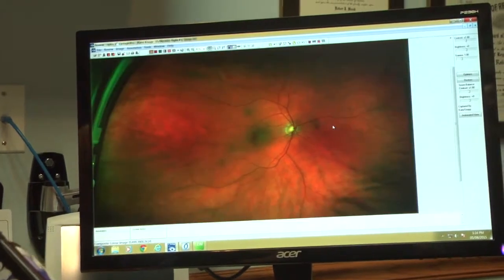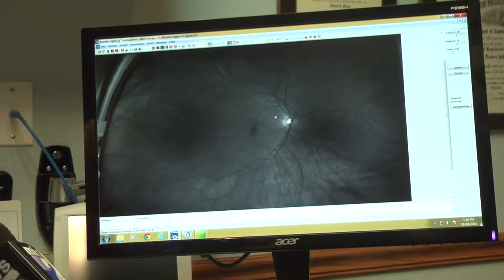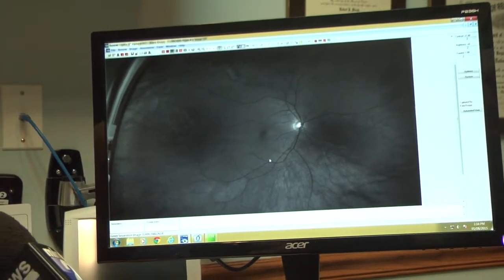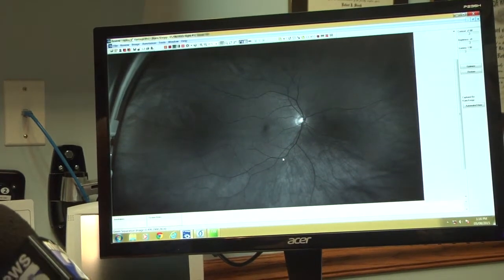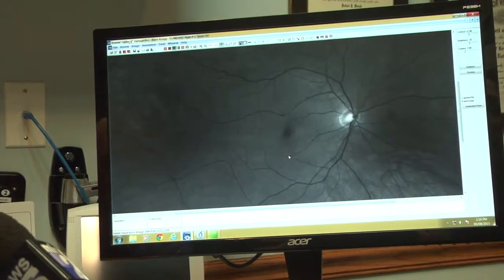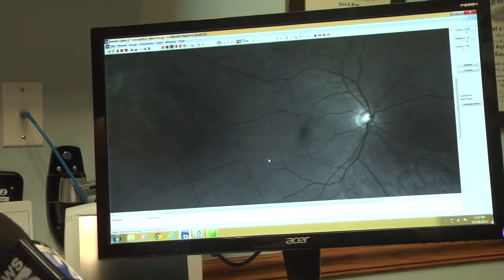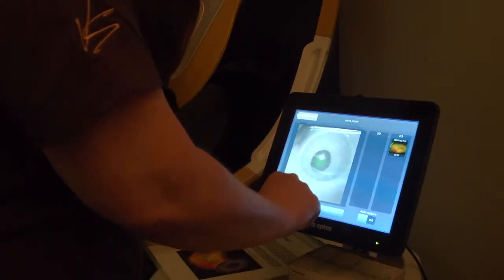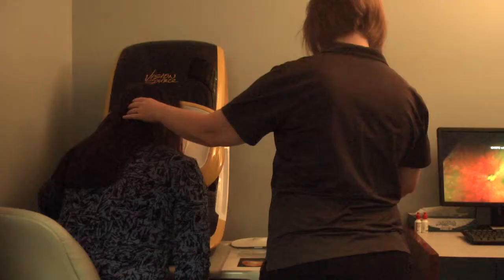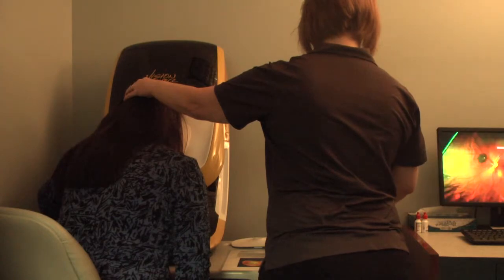One of the advantages, too, that we can look at with this technology is we can use one of the lasers, and these blood vessels stand out. They're not colored, but they stand out, and we can see the pattern of the blood vessels, which is unique for everyone, like a fingerprint. But also this technology for diabetes is great. Diabetics can have issues with blood vessels, and particularly in their eye. That's called diabetic retinopathy. And we can look at the blood vessels in great detail and in almost the entire inside of our eye. Very interesting technology.